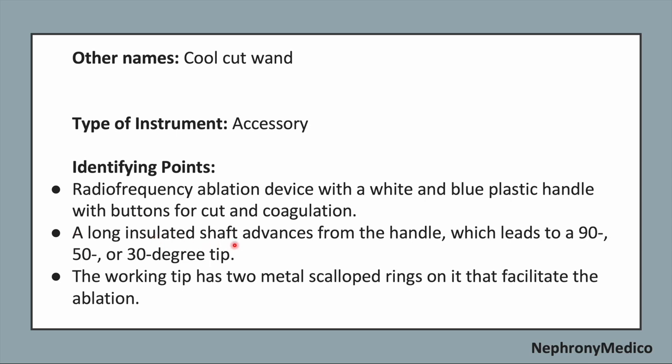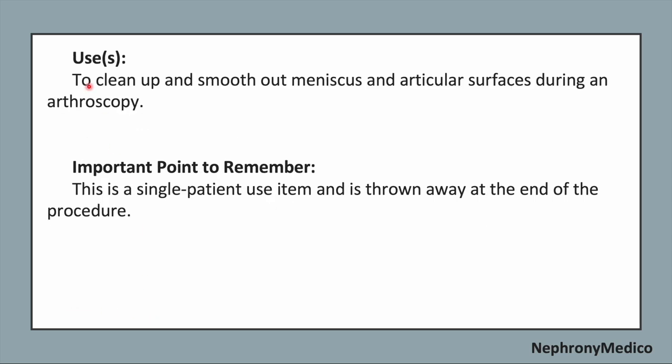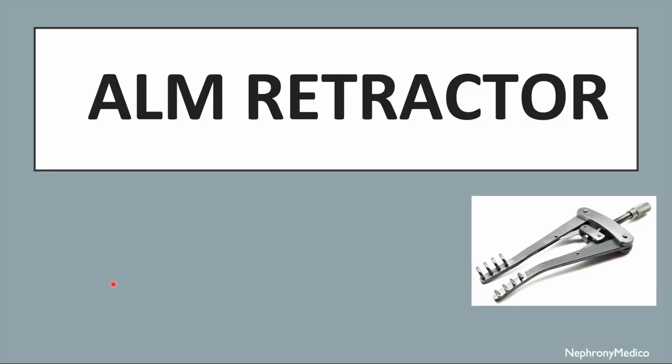A long insulated shaft advances from the handle which leads to a 90, 50 or 30 degree tip. The working tip has two metal scalloped rings on it that facilitate the ablation. Use: to clean up and smooth out meniscus and articular surfaces during an arthroscopy. Important point to remember, this is a single patient use item and is thrown away at the end of the procedure.